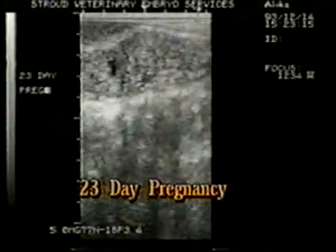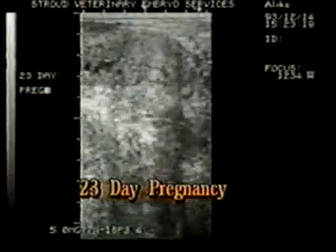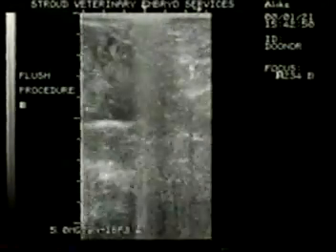It is advisable to wait until day 27 of pregnancy before making a diagnosis of open, due to the variation in volume of pregnancy fluids from cow to cow and apparent differences in embryonic developmental rates.